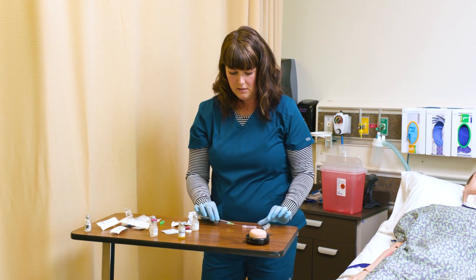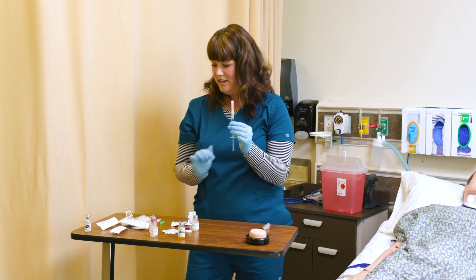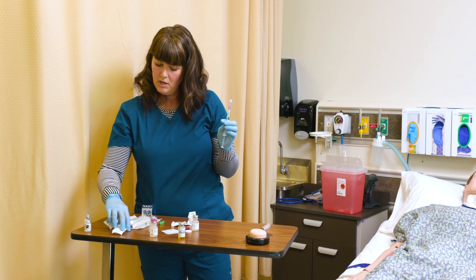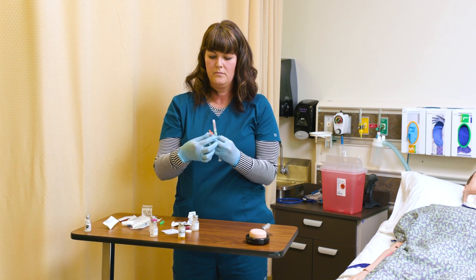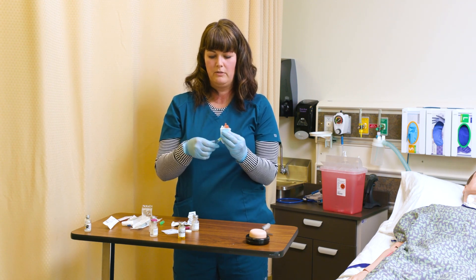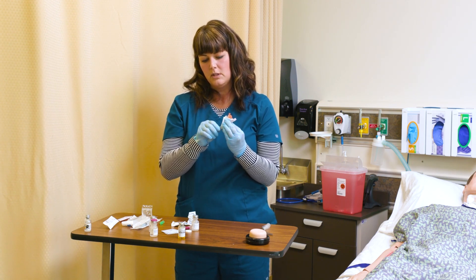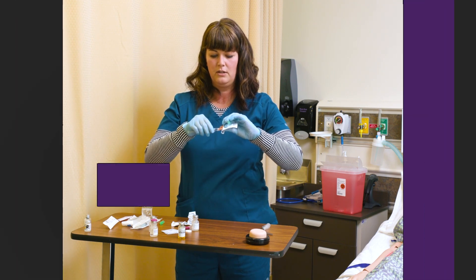Let's recap this. I don't inject a human with a filter needle — I need to choose a different needle. Let's show you a one and a half inch. This is a 22 gauge, one and a half inch. I'm going to remove the filter needle and attach my injection needle.